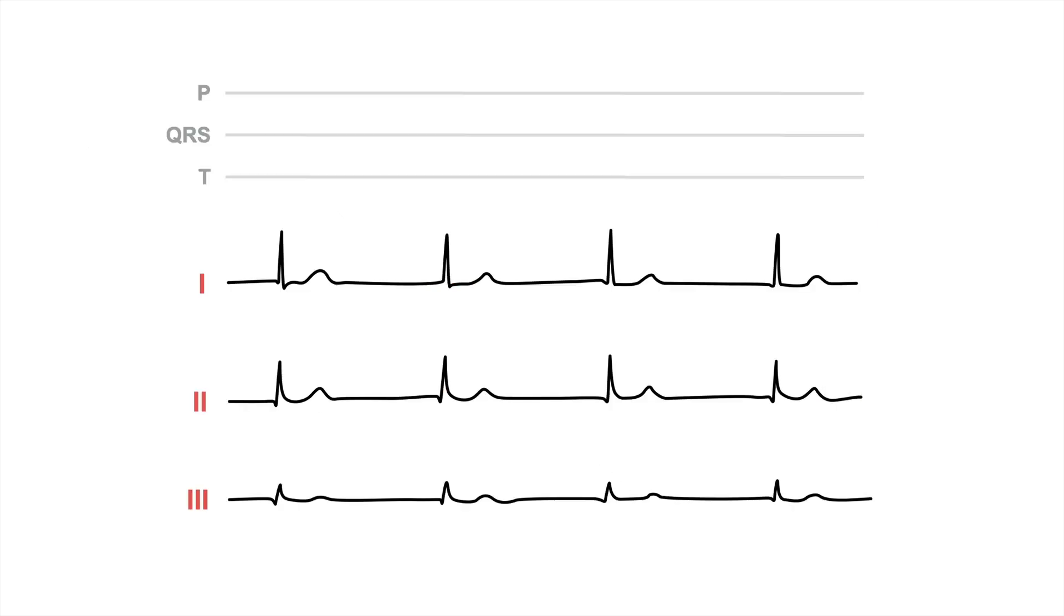Now let's check out this case. Where are the P waves here? Try to identify the QRS complexes and then the T waves first. So here's a QRS complex followed by a T wave, another QRS, T, QRS, T, QRS, T.